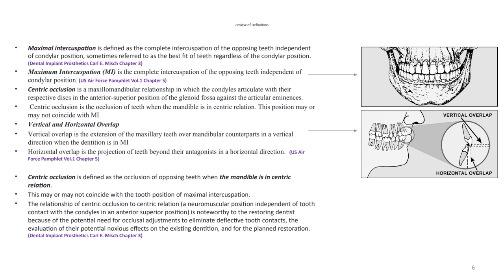It's very important to note here that there are more and more trends in dentistry about using sometimes a centric occlusion or a centric relationship when mounting the case instead of maximal intercuspation.